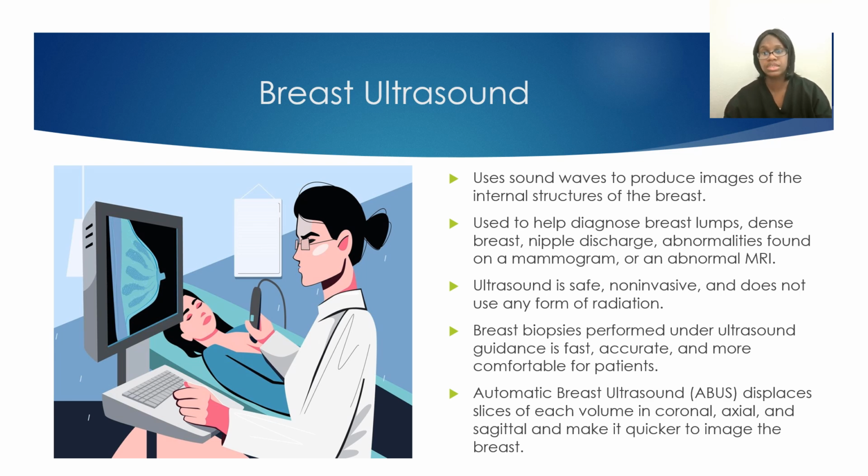Your breast ultrasound uses sound waves. It does not use any type of ionizing radiation. It is safe unless you have a technologist doing the scan who does not know what they're looking at or what they're doing. You can perform biopsies under breast ultrasound.